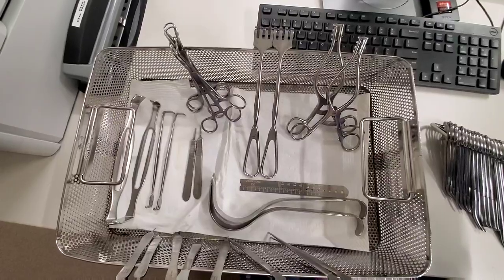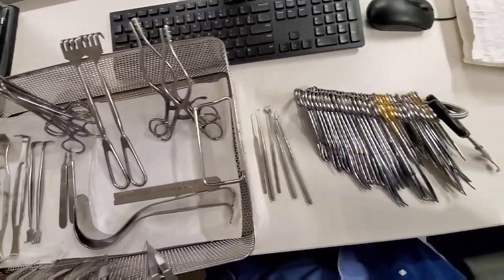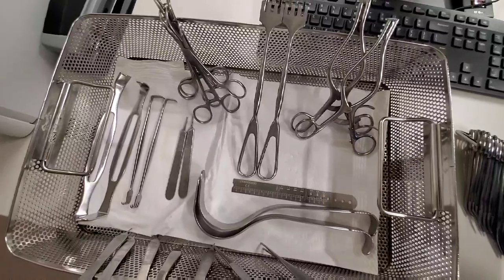Hi guys, in today's video I wanted to go over this plastic tray slash minor. I kind of broke it down just so you guys could see, and we're gonna go over each one of the instruments.